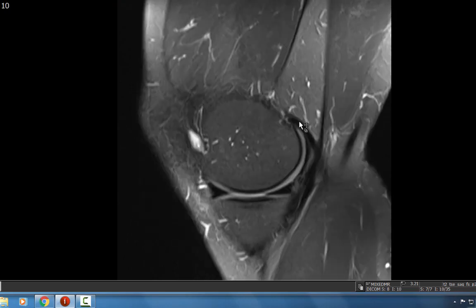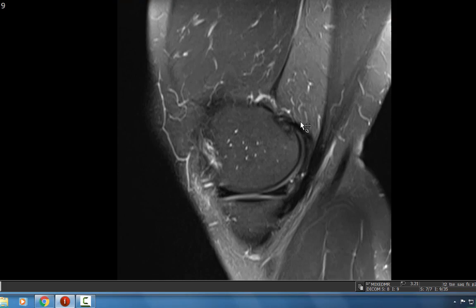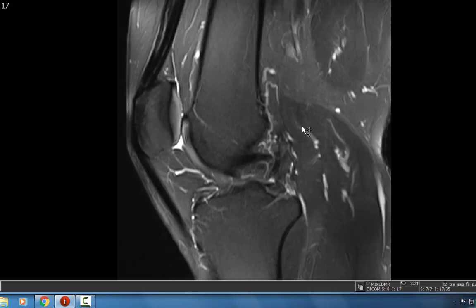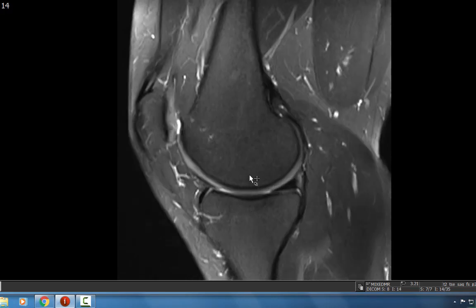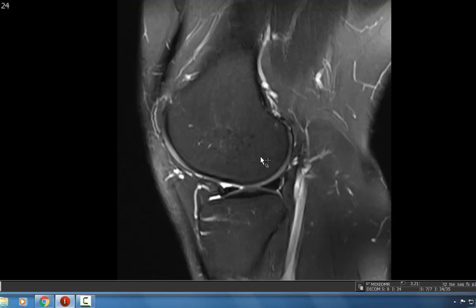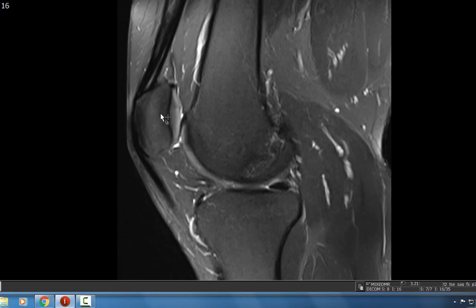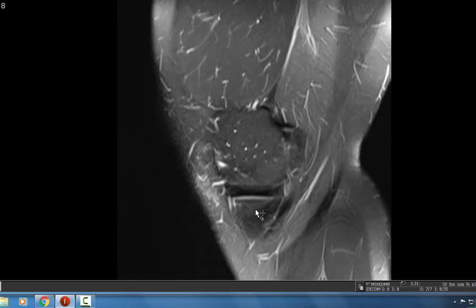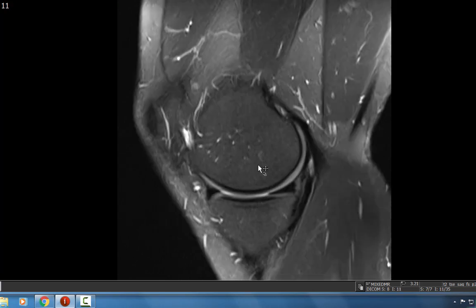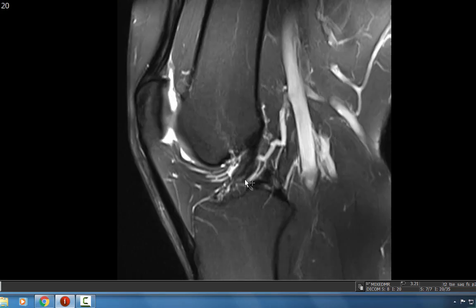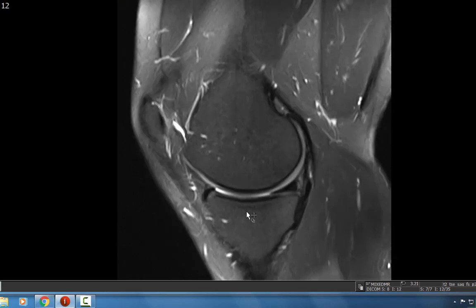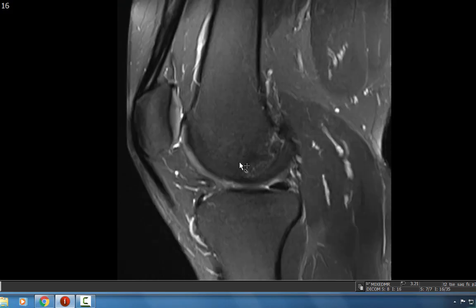I start usually with the sagittal T2 fat sat image of the knee and what I look for is marrow edema. The knee is divided into three different compartments: the medial femoral tibial compartment between the medial femoral condyle and medial tibial plateau, the lateral femoral tibial compartment along the lateral femoral condyle and lateral tibial plateau, and the patellofemoral compartment between the patella and the femur. So far, this is a relatively normal knee MRI — we don't see any marrow edema or T2 hyper-intense signal to suggest a contusion, degenerative changes, or any marrow replacing process.